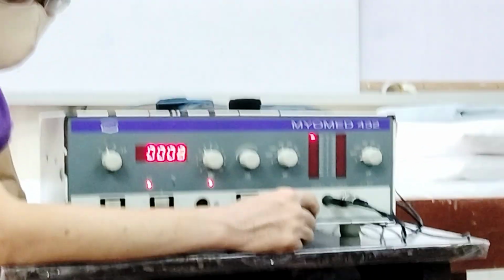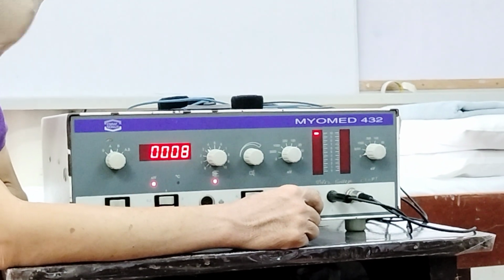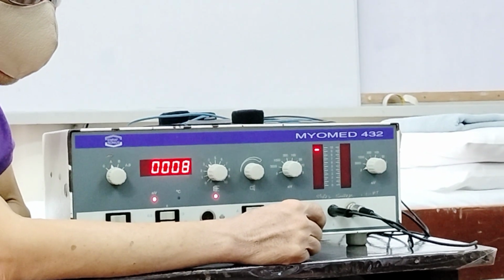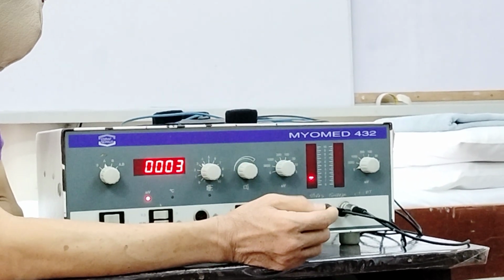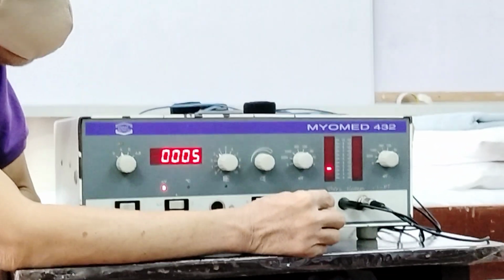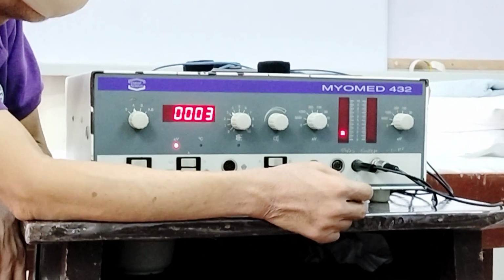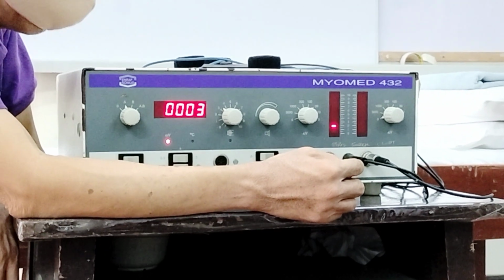Okay. So let's just say at 10 microvolts, na kaya niya ang level 10 or maximum level. So what you're going to do now is you're going to further progress that to 30. So pag 30 na, mas challenging na siya again. So the bar would now further go down. So you encourage the patient, so sige sir, I want you to bend your wrist so that this bar would further go up.